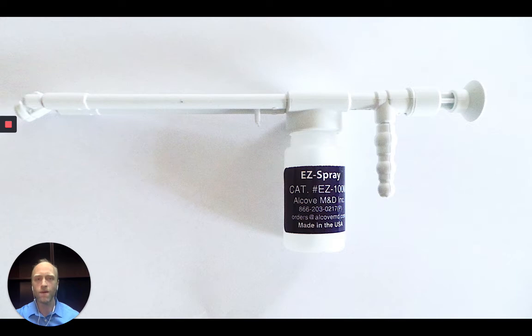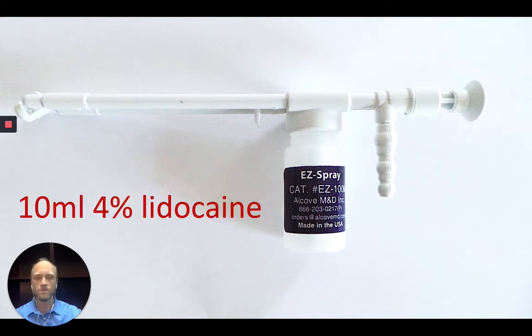The Easy Spray Atomizer is the device I like to use to deliver atomized lidocaine. The plunger gives you nice control over when your medication is delivered, and the bendable tip gives you control over where your medication is delivered. I generally use about 10 mL of 4% lidocaine. It can be sprayed directly into the mouth or through the nose.